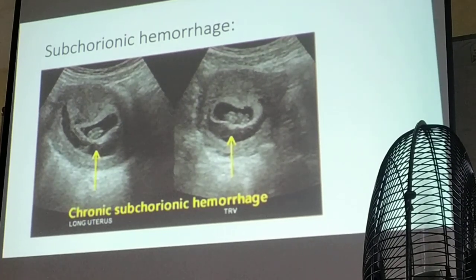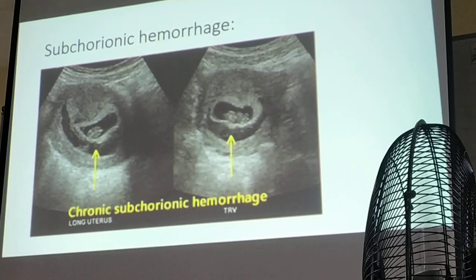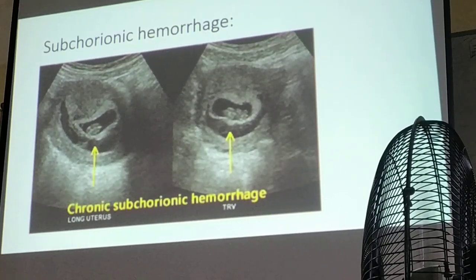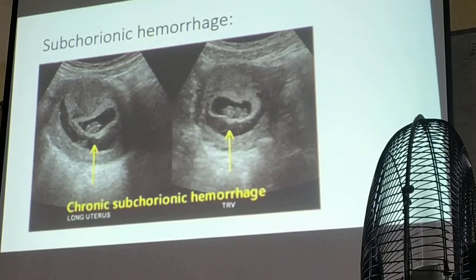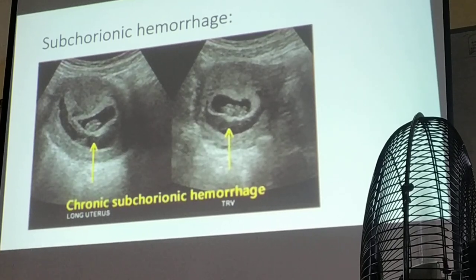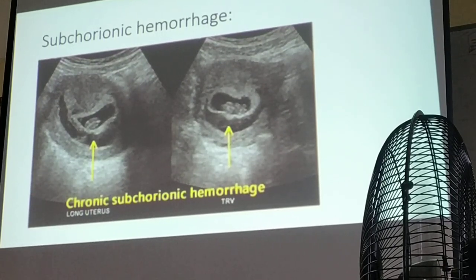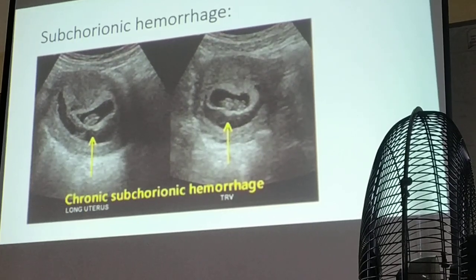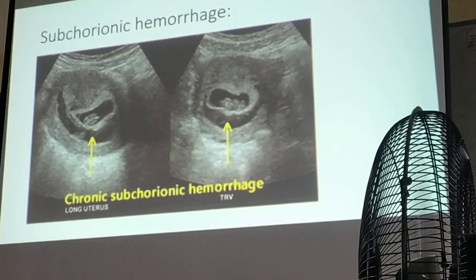What are you thinking if you see that answer, hydroperitoneum? Diba meron pneumoperitoneum? When you say pneumoperitoneum, presence of air in your abdomen, right? So when you say hydroperitoneum, it's referring to presence of fluid. So that's also ascites. So I consider that.